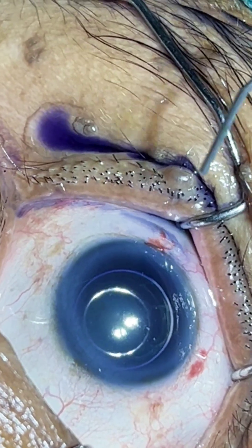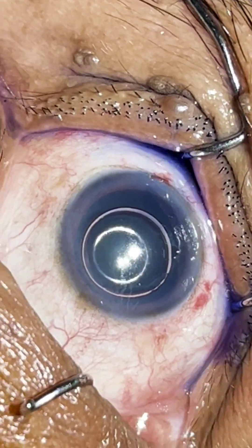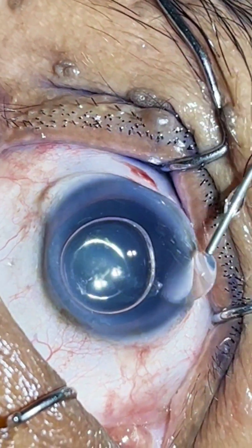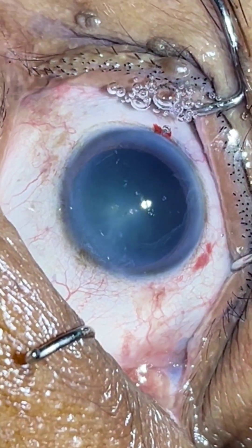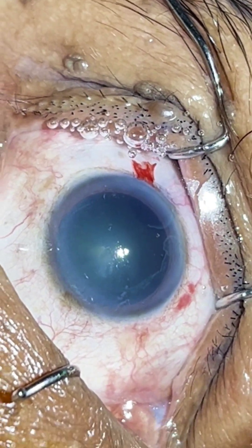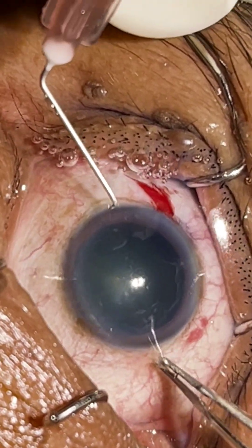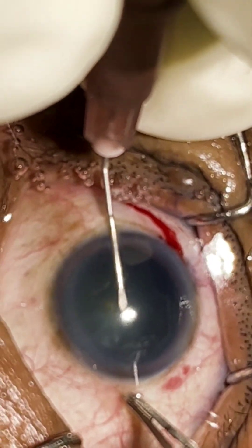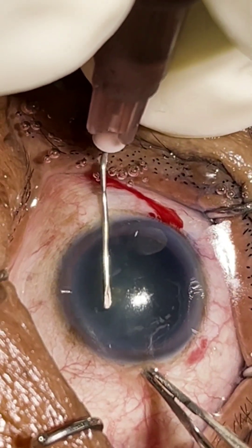I give the trypan blue dye. Now as it is a topical case, I am giving oculine intracameral.